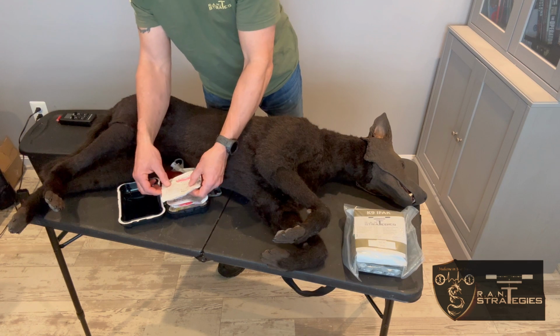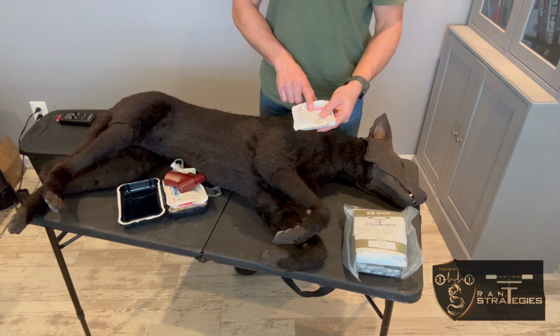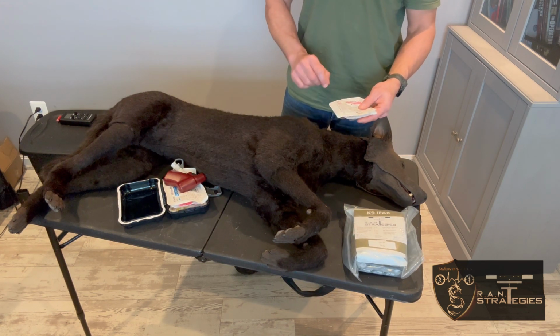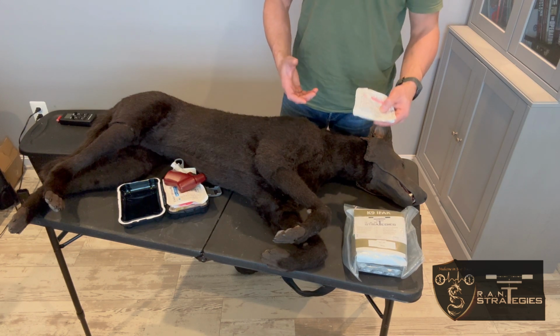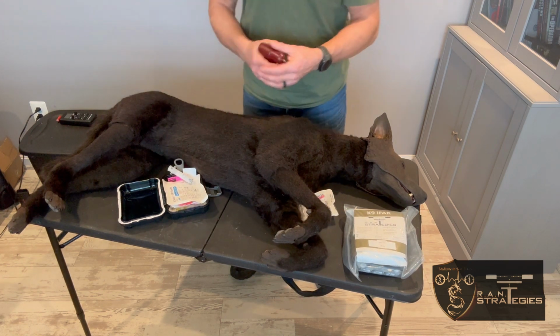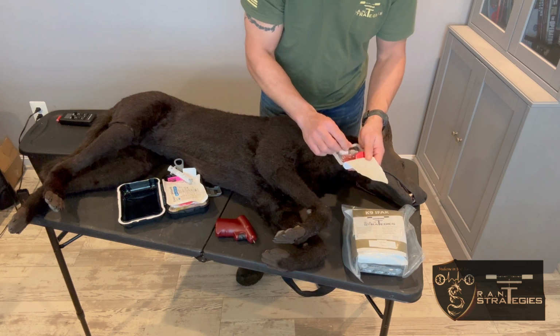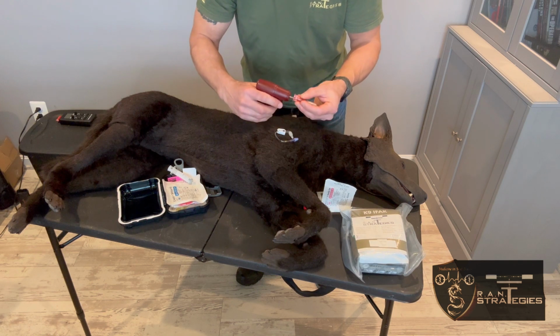So if you're using the Easy IO set, which has worked very well for us, you'll notice that they are weight-based. This one is for 3 to 39 kilograms. The mean of your working dogs is right around 35 kilograms. So the pink needle set is perfect. We check our drill, make sure it's good. We can open this up, remove our tubing. We can attach our needle to the drill.